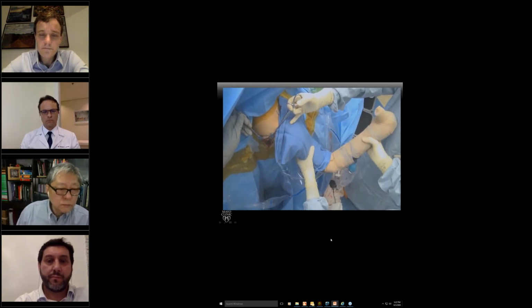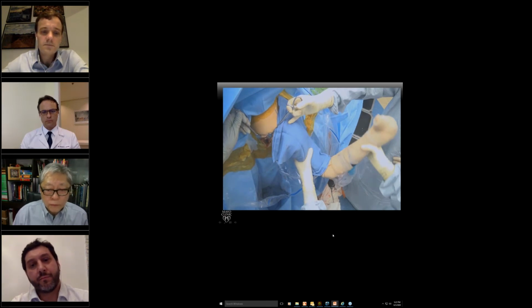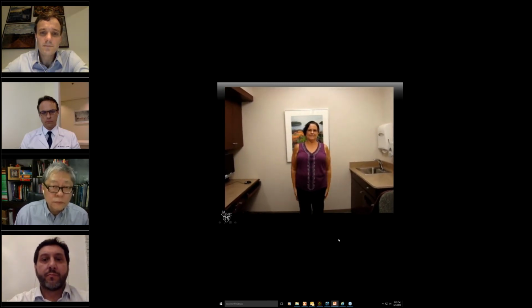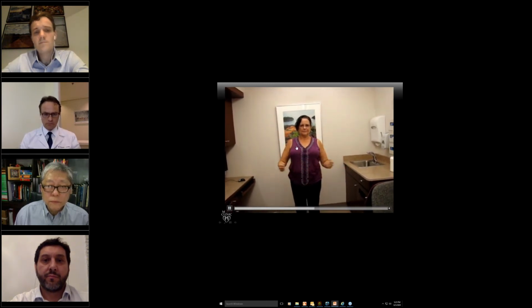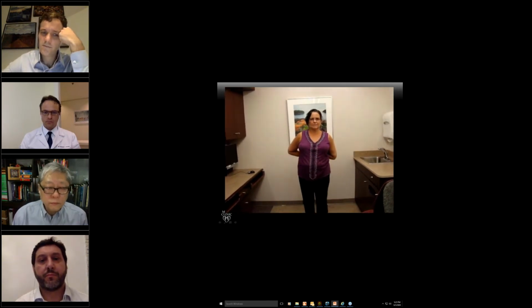Okay, so this is step by step the technique for the audience, because I get asked about the technique, and many times I go through material and we don't go through the technique very well. I'm not going to show it. Anyone who's interested, I can send you tons of videos about patients and their functional outcome. Like this patient has a massive posterior superior tear. You can see slight difficulty in abduction, and she is super, super happy with all her motion.